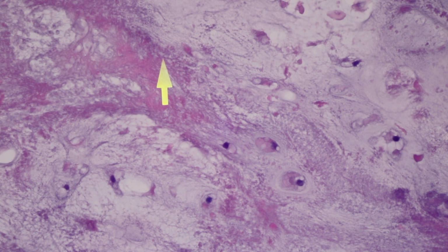In the setting of calcification, it's meaningless because normally, biologically, as we talked about in the growth plate, when matrix mineralizes, chondrocytes die. If I see no mineralization and dead chondrocytes, yes, I will start asking myself, is this a chondrosarcoma or not? But in and of itself, necrotic chondrocytes are not diagnostic of chondrosarcoma.